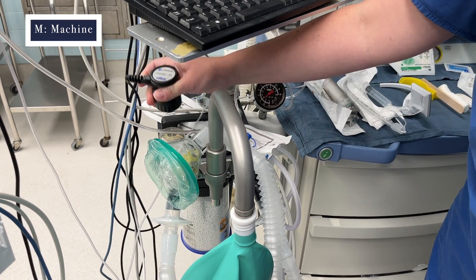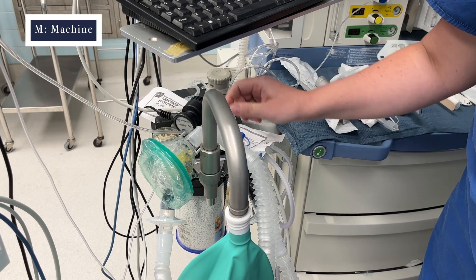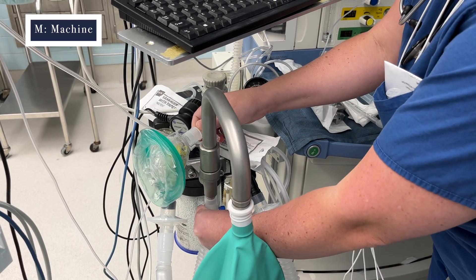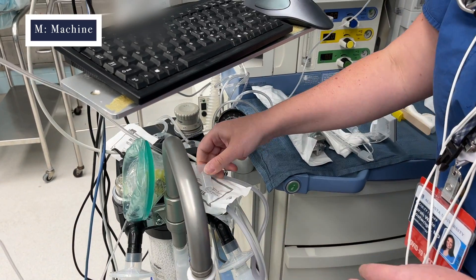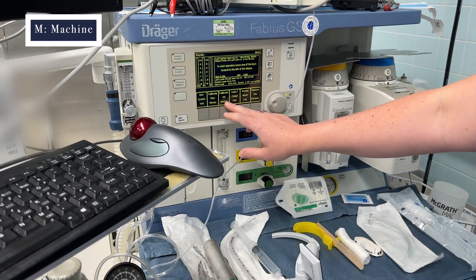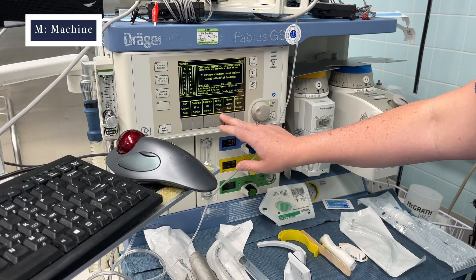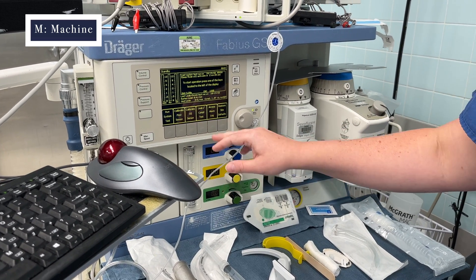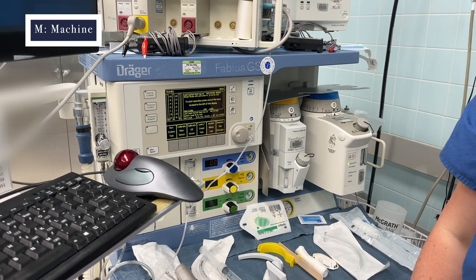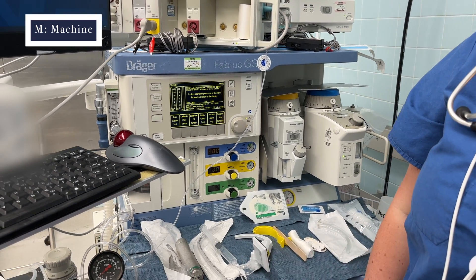You want to remove your oxygen sensor so that it can be calibrated, connect your whole circuit so you can check for leaks, and then run the automated tests on your computer screen. There are four separate tests and it tells you what to do for each one — just press start and it'll run through.